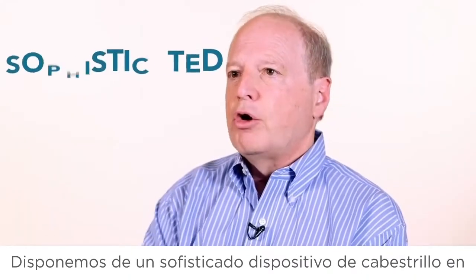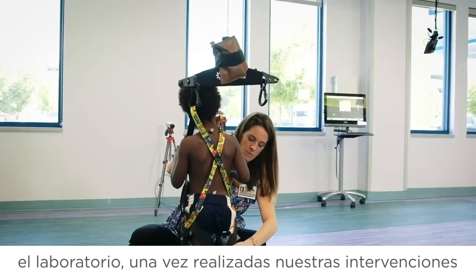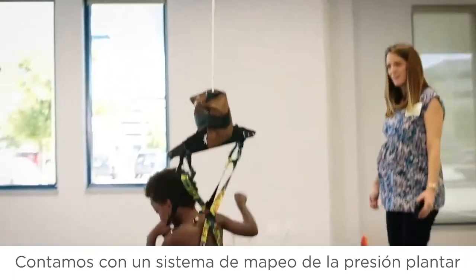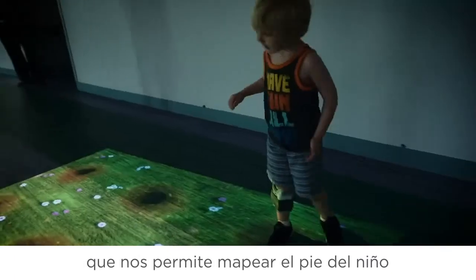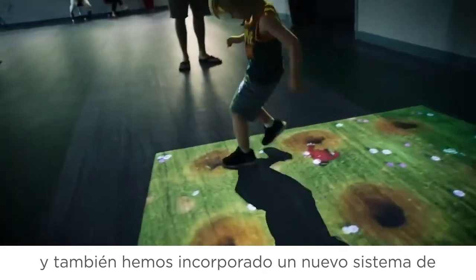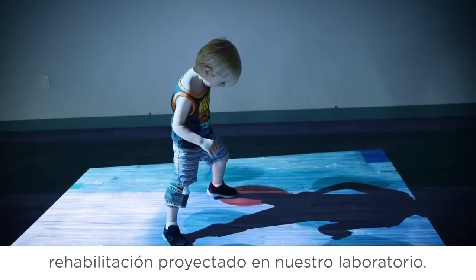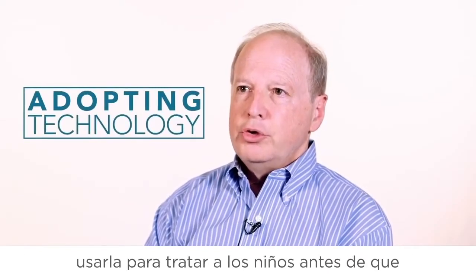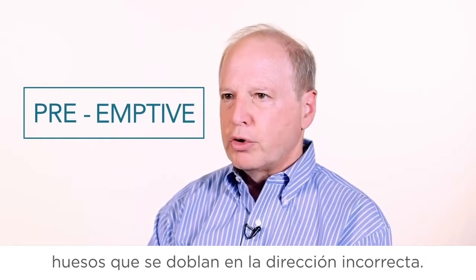By integrating a sophisticated harness device into the lab, we can measure whether we are supporting less of their body weight over time with our interventions. We have a plantar pressure mapping system that allows us to map the child's foot. We have also incorporated a new projected rehab system into our lab, and we've been very aggressive about adopting this technology to treat children before they develop secondary complications like joints that won't move and bones that are bent in the wrong direction.